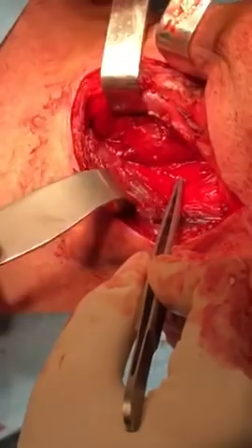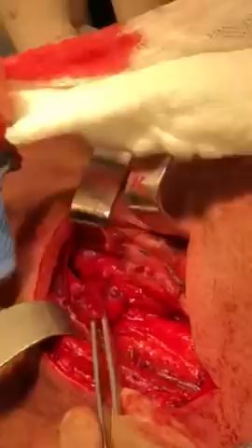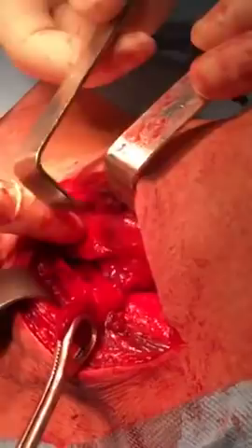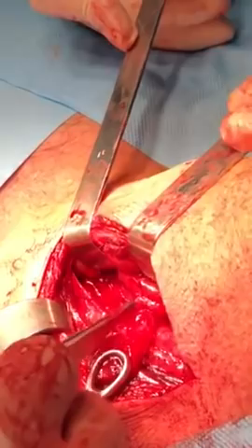This dissection is done very carefully in this plane. The pouch has been found. The approach is almost always on the left side. The pouch has been totally dissected and freed as a mucosa from the esophagus and surrounding structures. A myotomy has been done below the pouch of the esophagus.